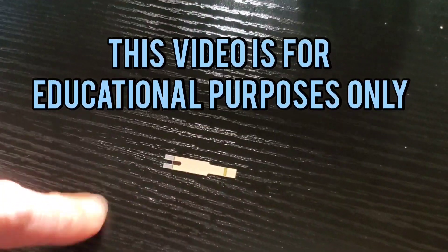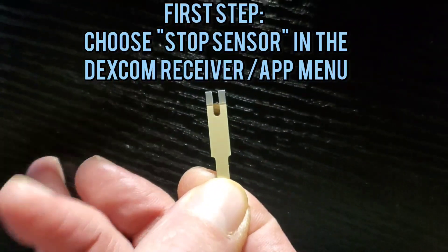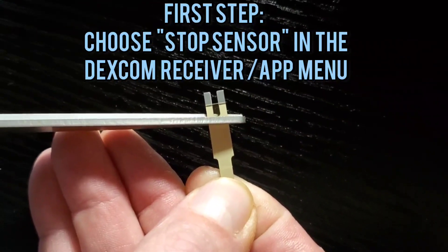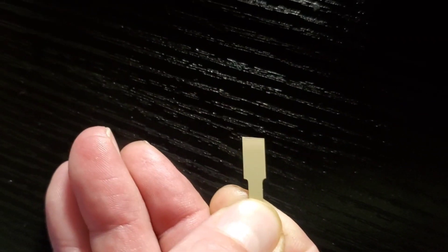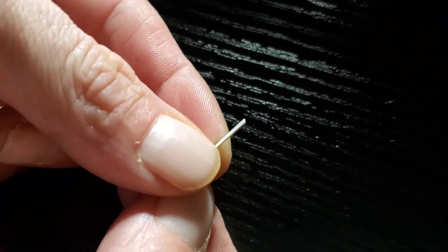We're going to take this strip and cut the top off so that it's nice and flat, because we need it to be flat — maybe a little bit of an angle so that it goes in easier. Now we've got the strip ready to go inside the transmitter.